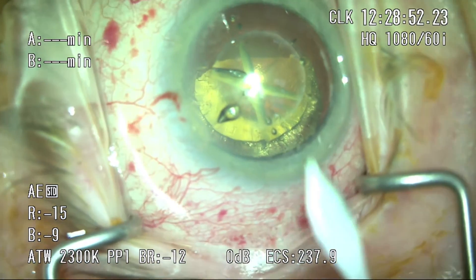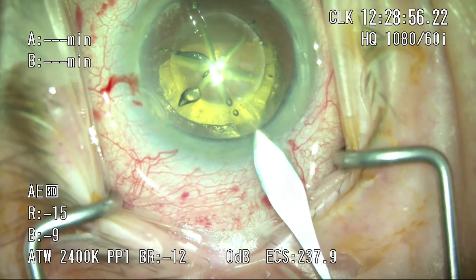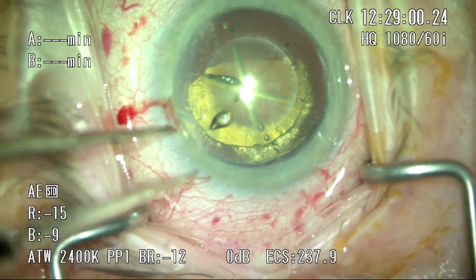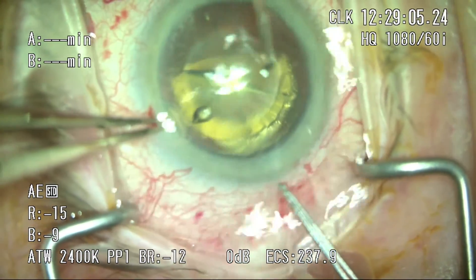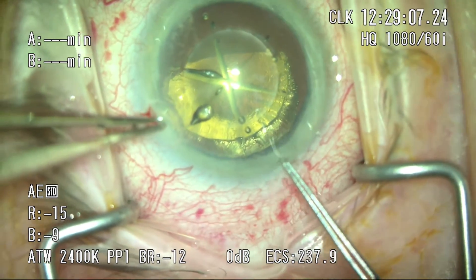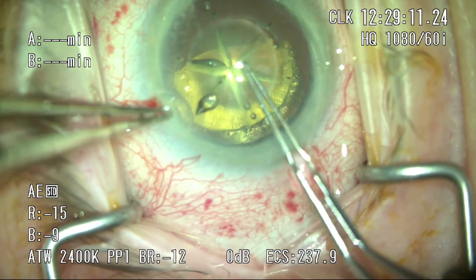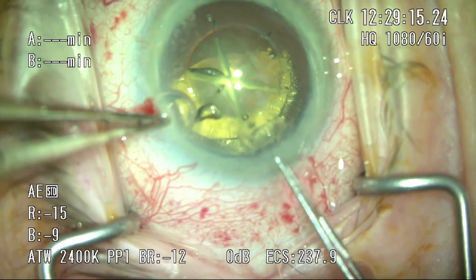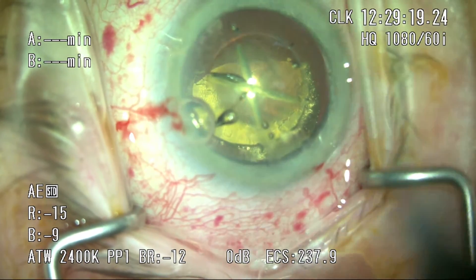Next, I'm going to make the main incision using a 2 to 2.2 millimeter trapezoidal blade. We do use a MICS system and find it very effective. I'm going to hold onto the side port blade as a habit, then take the Utrata forceps and grab the middle of the capsulotomy and create a small circular pattern to ensure I have a free-floating capsule in case there are any adhesions. Here, there are absolutely no adhesions and the capsule comes out very easily and cleanly.